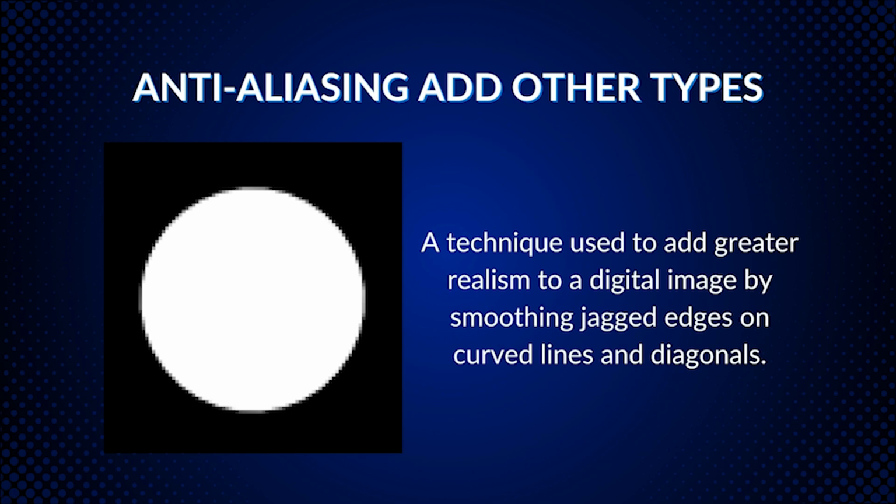If the edges are 20 microns, but my printer only prints 50 microns, there's a gap there where it won't print or it can't connect correctly. So I use anti-aliasing. What that does is it takes your pixel size on the right side and smears it together, giving you a smoother surface. Does that impact accuracy? Very little, not on the scale that we're working in.